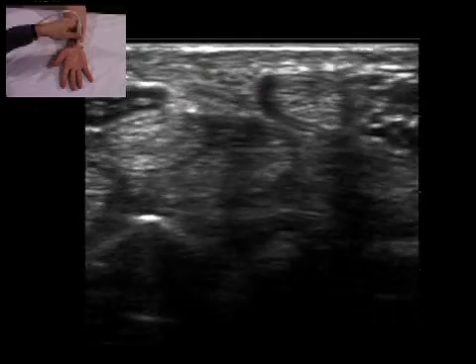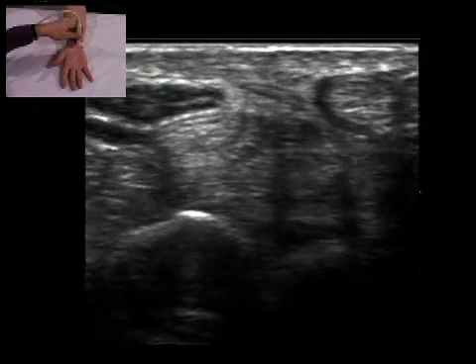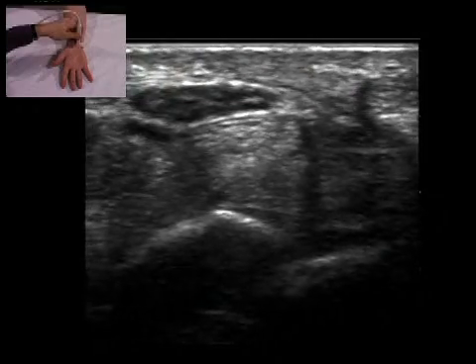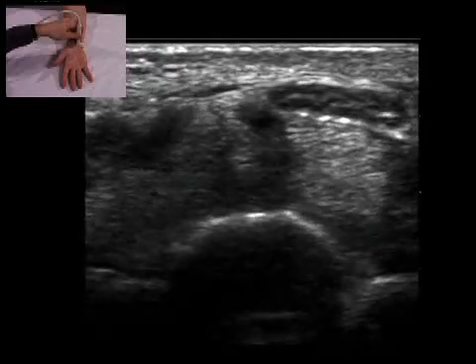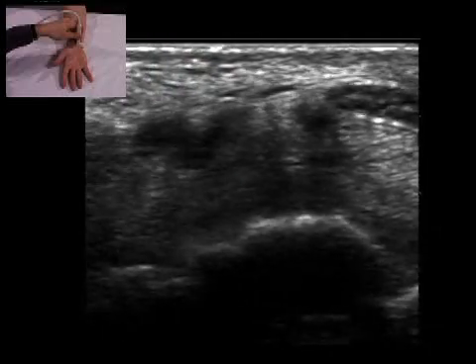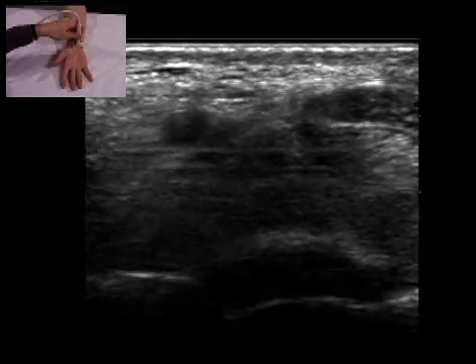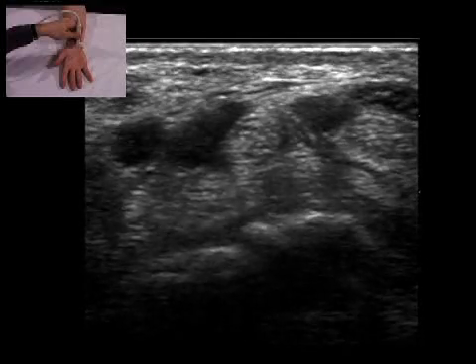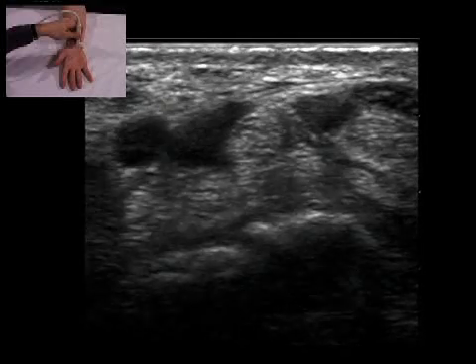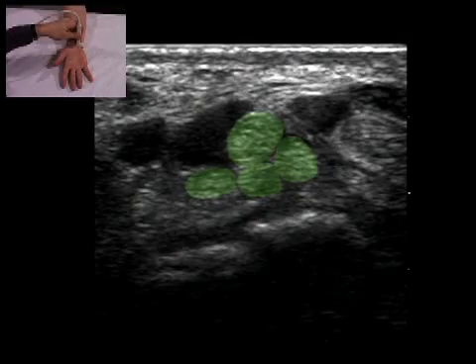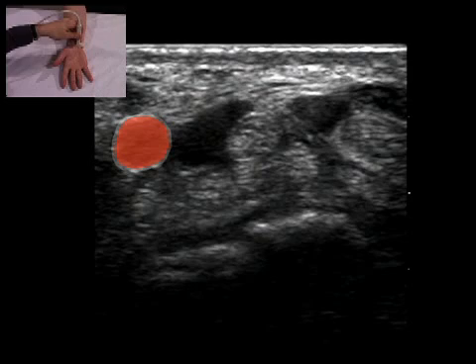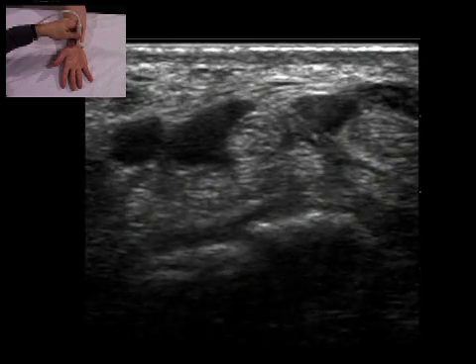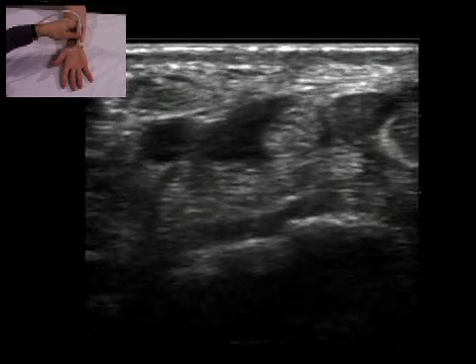The probe is now moved to the ulnar aspect of the carpal tunnel. Flexor digitorum tendons are observed on the ulnar aspect of the median nerve, and the ulnar artery and nerve are observed outside the flexor retinaculum.